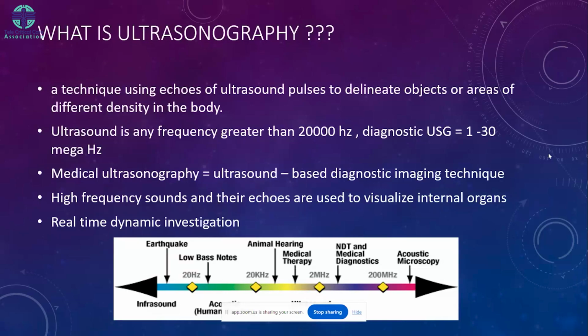Medical ultrasonography basically is the use of this ultrasound to make diagnostic imaging techniques. These high frequency sounds and their echoes are then used to visualize the internal organs. It's a real-time dynamic investigation.